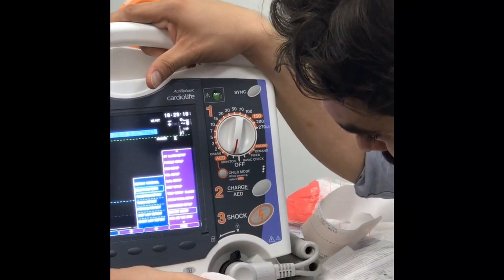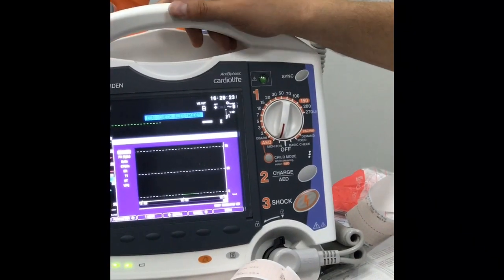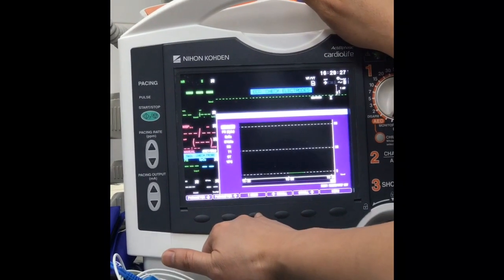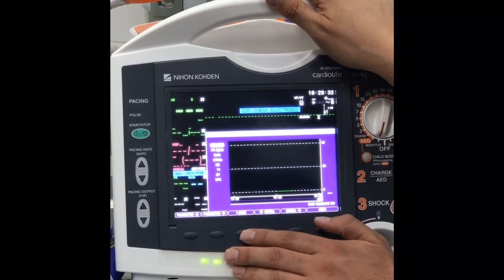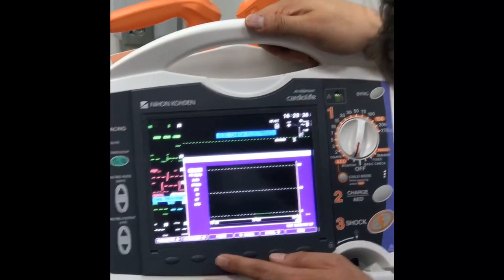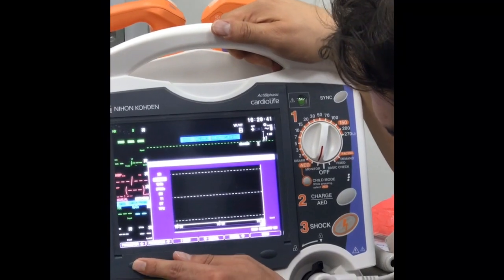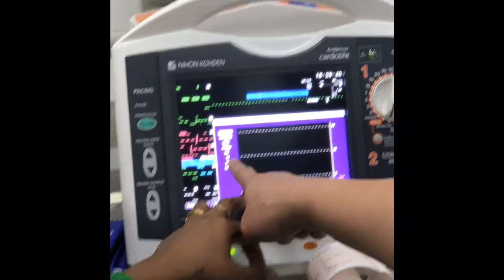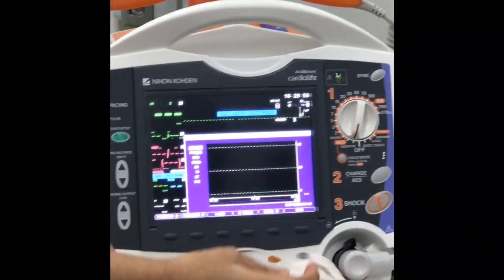I think this is the simulator. Long 10 minutes, but this is the time scale. There is no blood pressure here. Can you add the blood pressure in the trend report? Sure. Go to the NIBP list report here. It is separate, I think. Yes, it is separate. I didn't know that. This is the blood pressure we need.